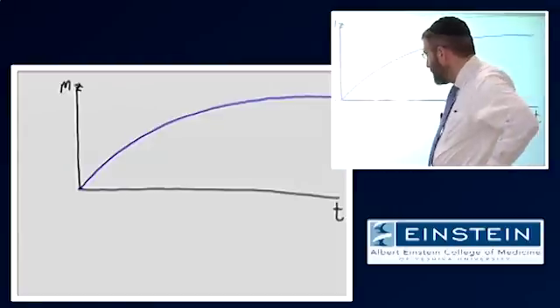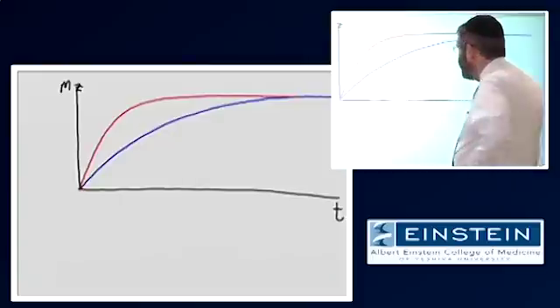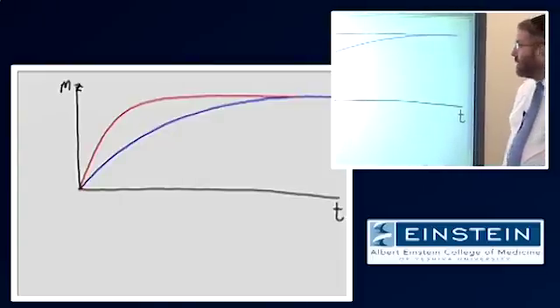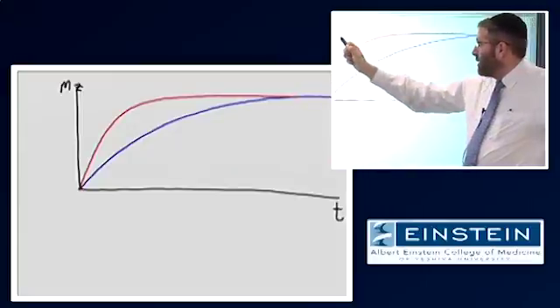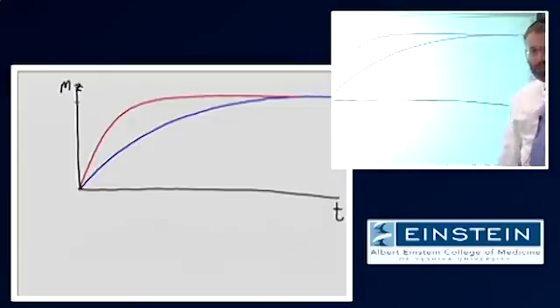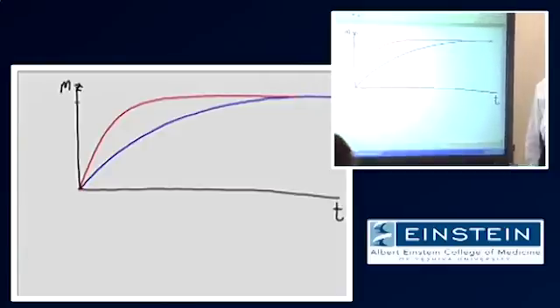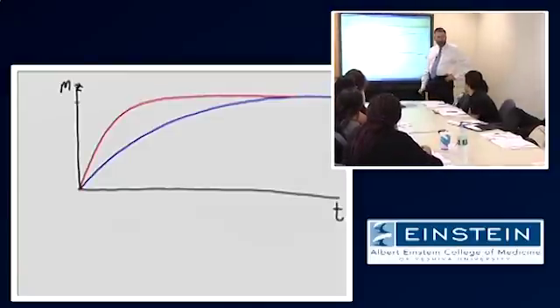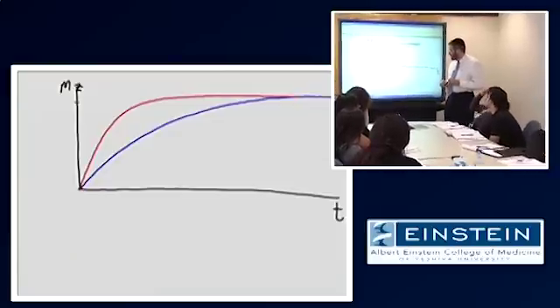And we can put, let's say, 2 different example tissues in here. Now, we see that these are all recovering to the same point. That tells us what about these 2 tissues, by the way? They have the same proton density, right? They ultimately have the same amount of longitudinal magnetization when they're fully relaxed.